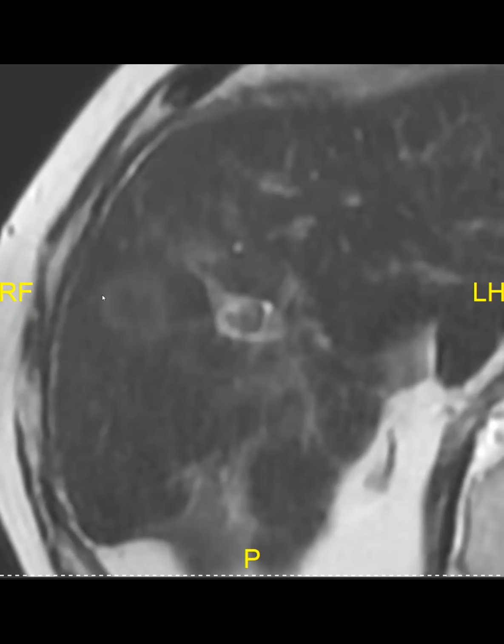the idea is that we have very stringent criteria for LR-5, very stringent criteria. So that's why, with the specificity, we have to keep it above 95%. We have to sacrifice sensitivity, which means that a bunch of HCCs will go into the LR-M category.